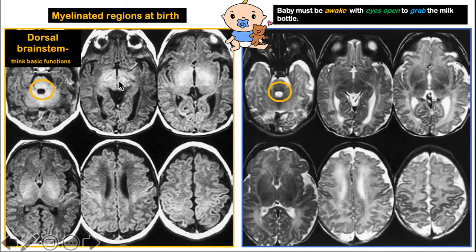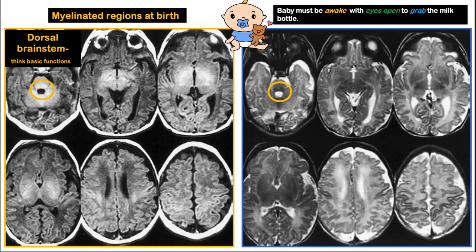Here are a set of T1 weighted and T2 weighted images in a newborn. To associate the dorsal brainstem region, we think about basic functions the brainstem allows. The baby must be awake, which corresponds to the reticular formation in the brainstem — so the dorsal brainstem is hyperintense on T1 and hypointense on T2.